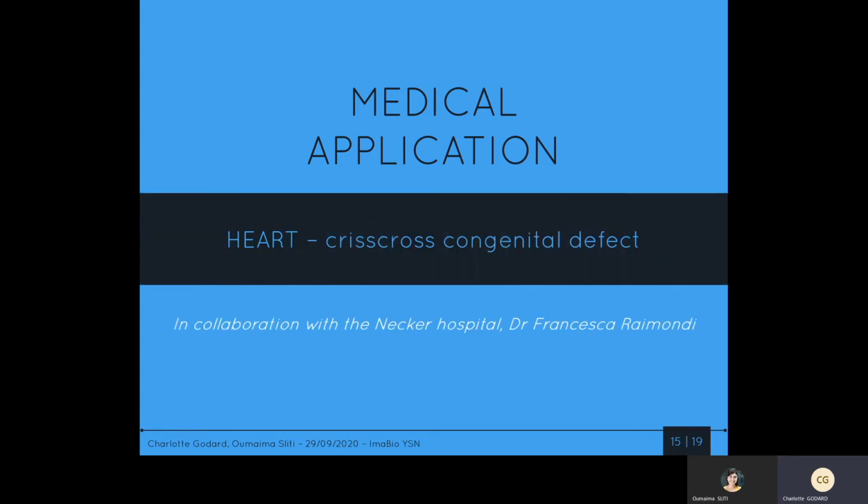Okay, so now the second possible application with DIVA is in the medical field. So here I will present you an example of a heart disease called criss-cross congenital defect. And this is a project in collaboration with Dr. Francesca Raimondi from the Necker Hospital.